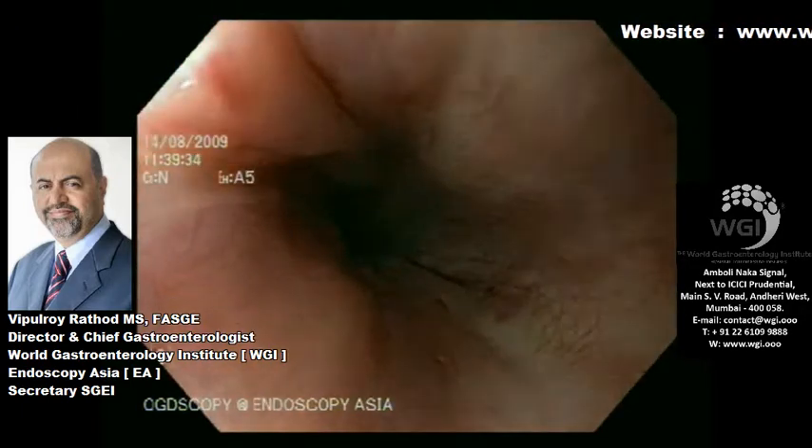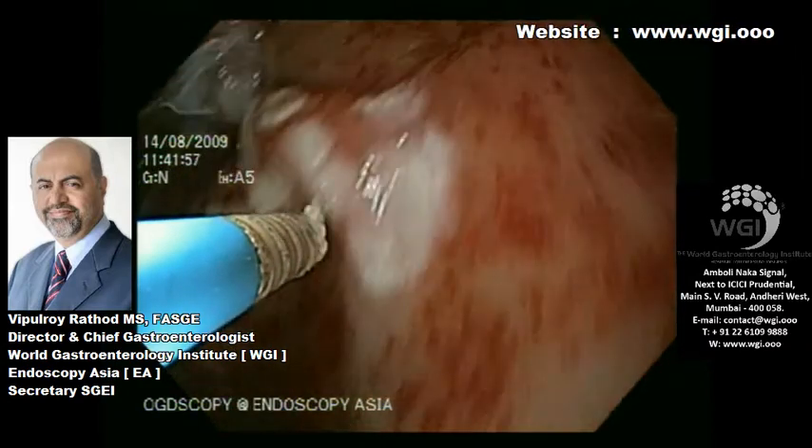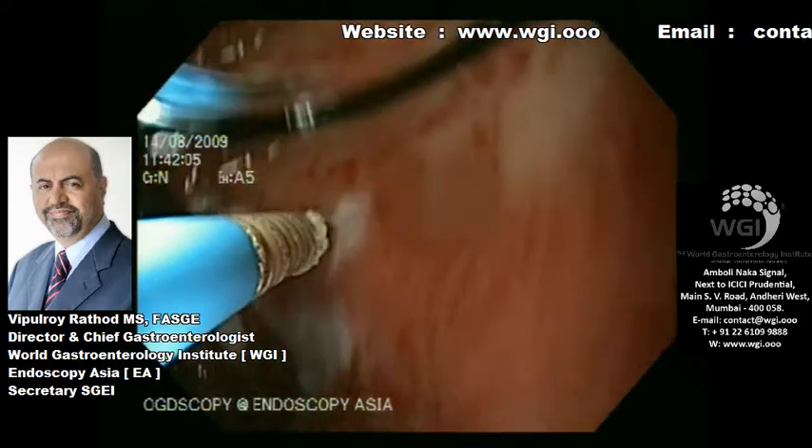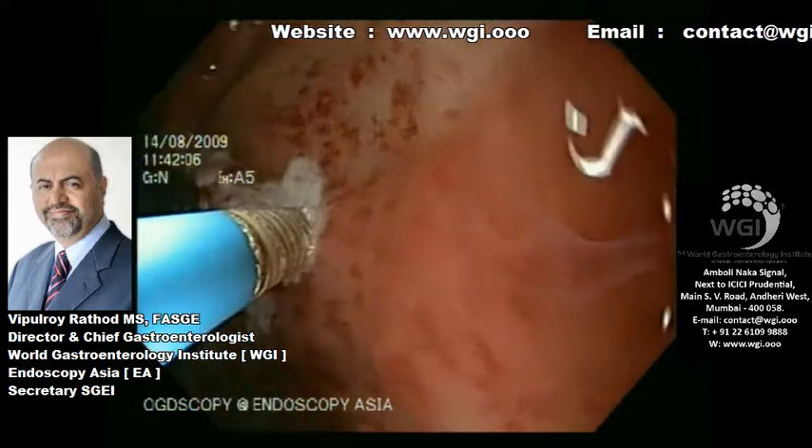He has also got some gastric fundal varices which were noted in a prior endoscopy. Over here, we are using a bipolar probe to coagulate these in entirety.